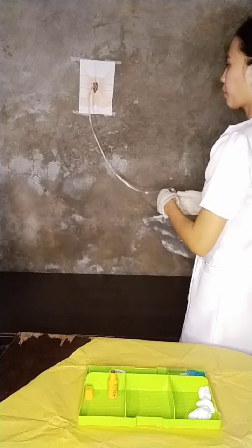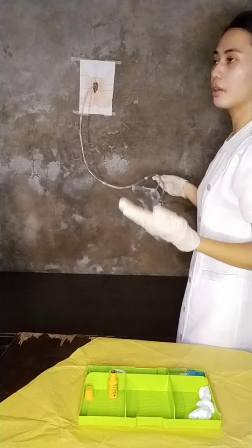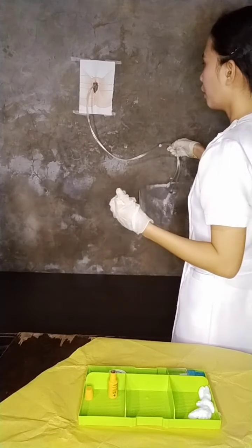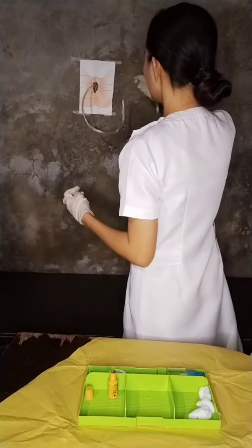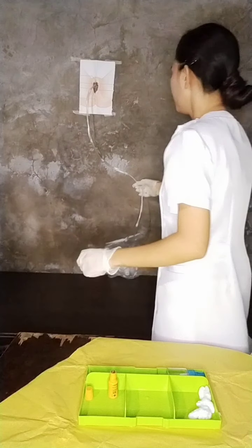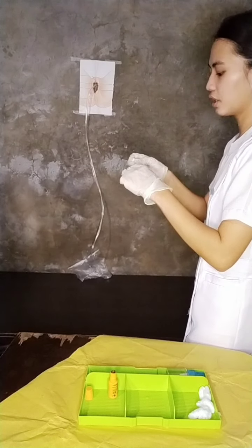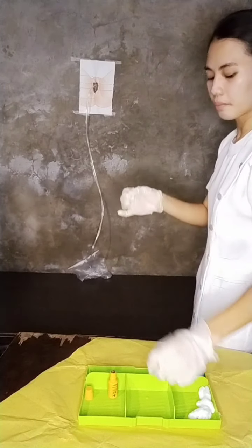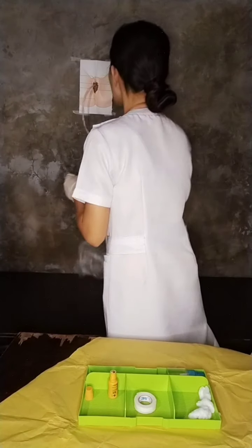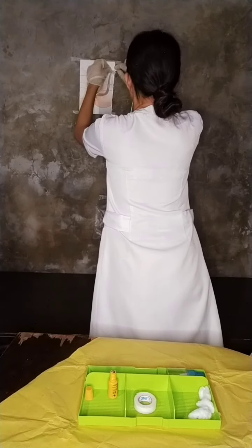And then after that, check the urine flow and the urine characteristics, and you can now secure the catheter to the inner thigh of the patient using a non-allergenic tape. Don't place it under the thigh of the patient because it can cause a pressure sore.